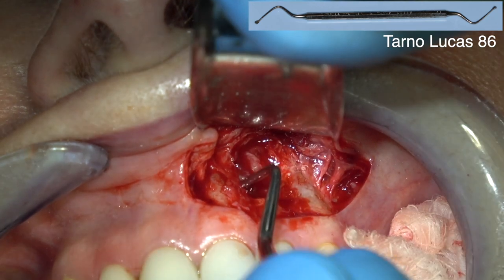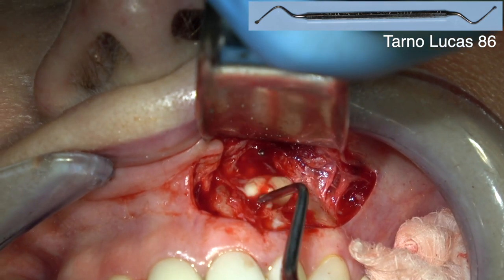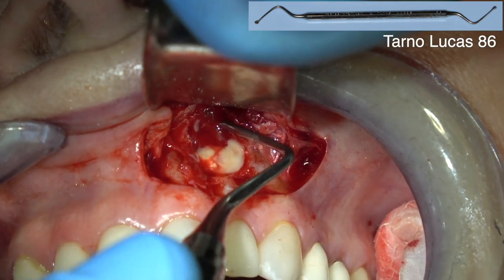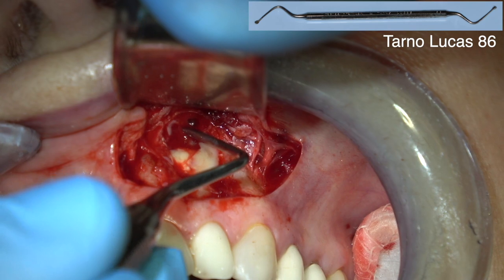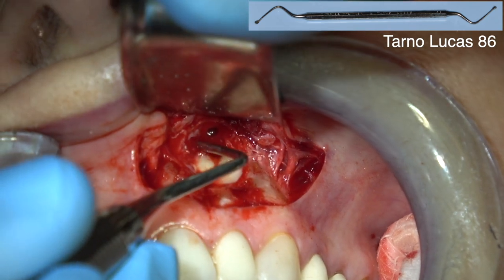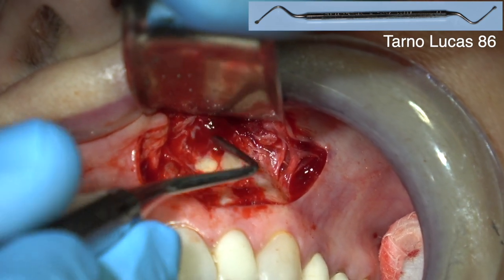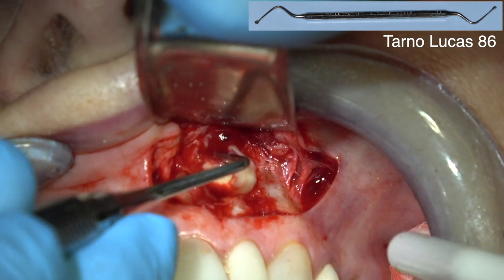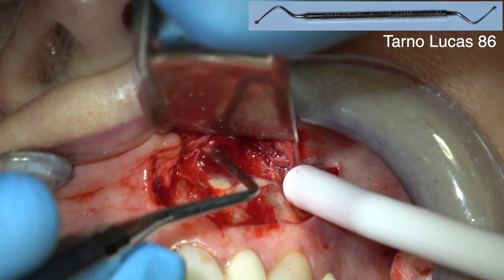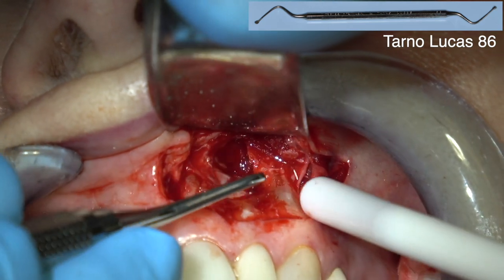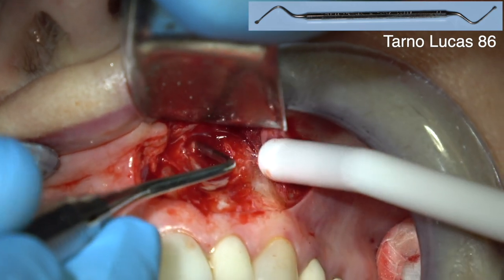This is a large spoon — a large curette — and I'm curetteing the remainder of that granuloma out with this large spoon. You want a large one, not a small spoon.